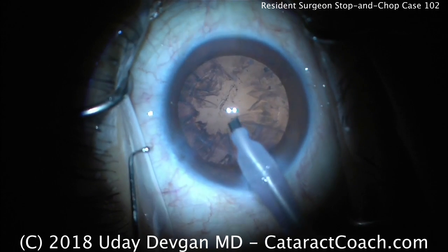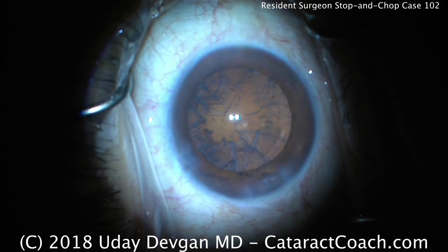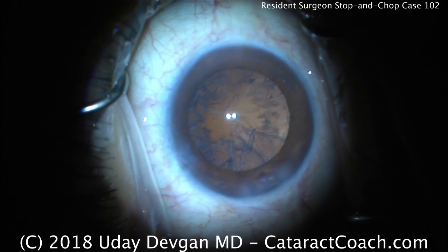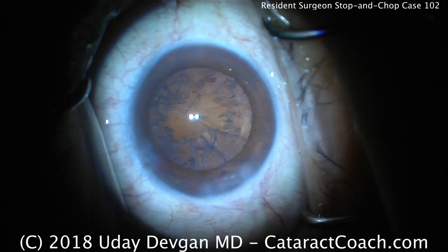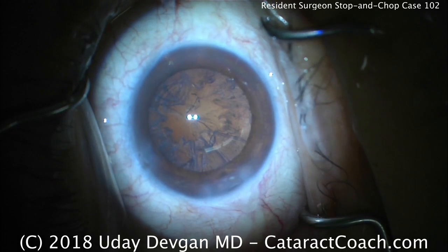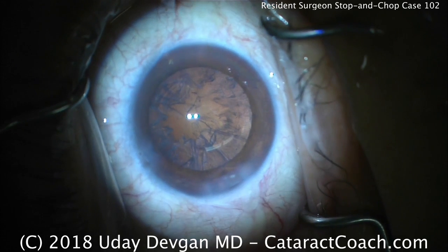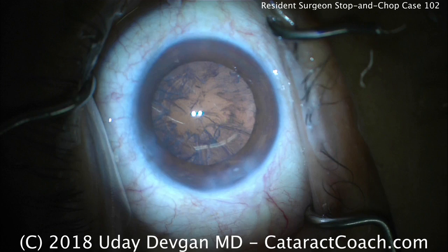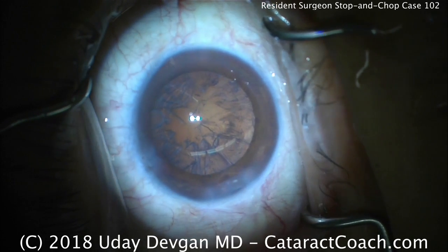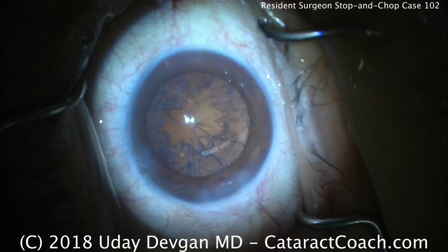Coming out of the eye — time for irrigation-aspiration. Very well done. Placement of the incisions I like; they're a little shy of 90 degrees away, maybe about 70 to 75 degrees between incisions. Anything between 1 to 3 clock hours away is typical. I tend to prefer about 2 clock hours away, or 60 degrees between the side port and the main incision.